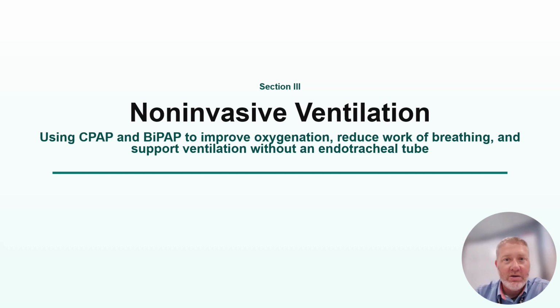While it can give some PEEP, it should not be used to deliver PEEP. It's more like an added benefit because it gives a little bit of PEEP. We just don't know how much, so don't think of it in those terms.